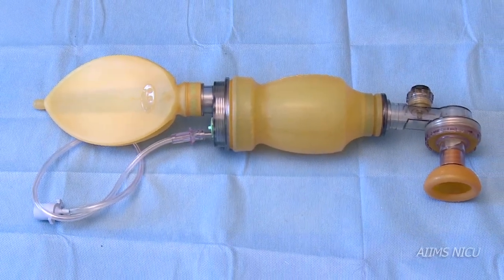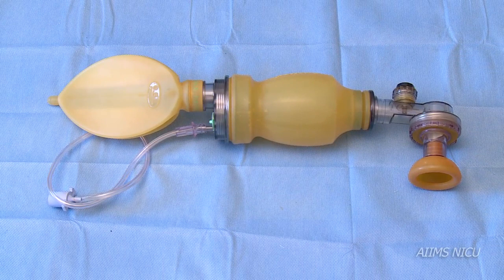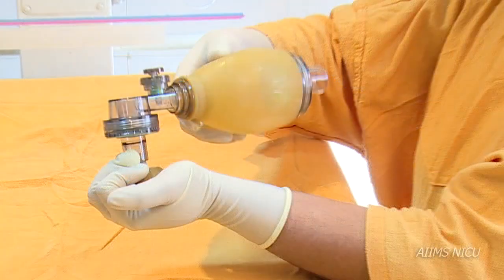In this video we shall learn about the use of a self-inflating bag for delivery of positive pressure ventilation. The self-inflating bag used for newborns usually comes in a capacity of 240 ml.